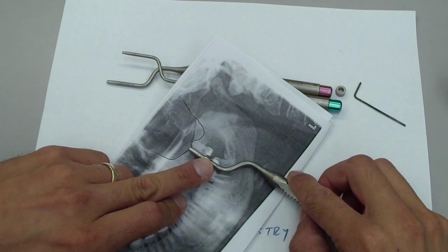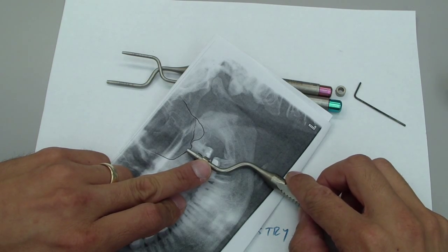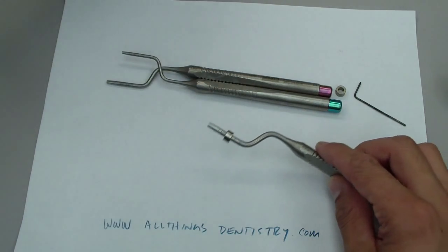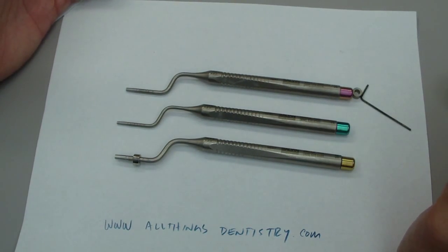And as you tap, it'll fracture the bottom of the sinus floor along with the membrane — the Schneiderian membrane — and then you start packing your bone. So that's that.